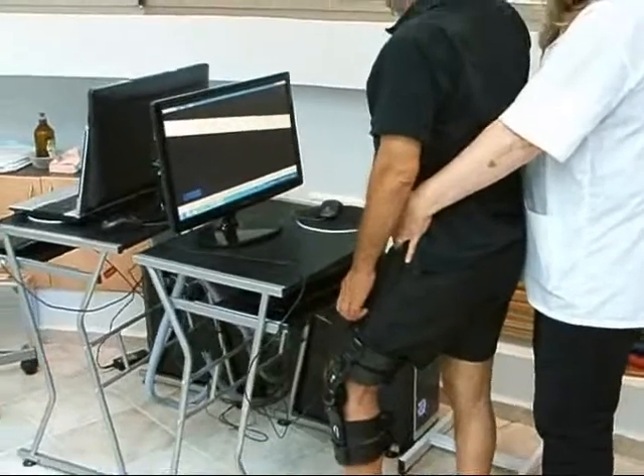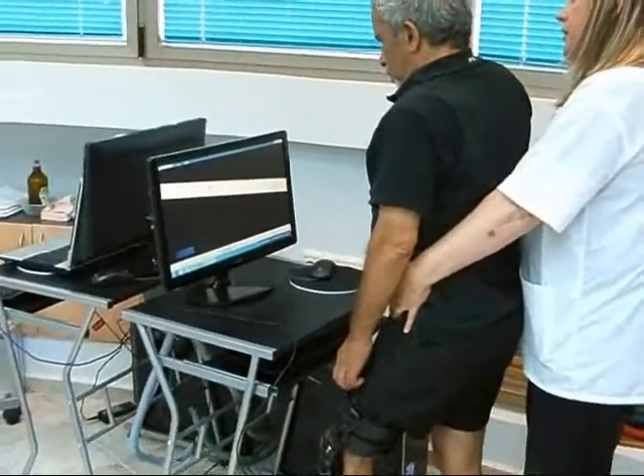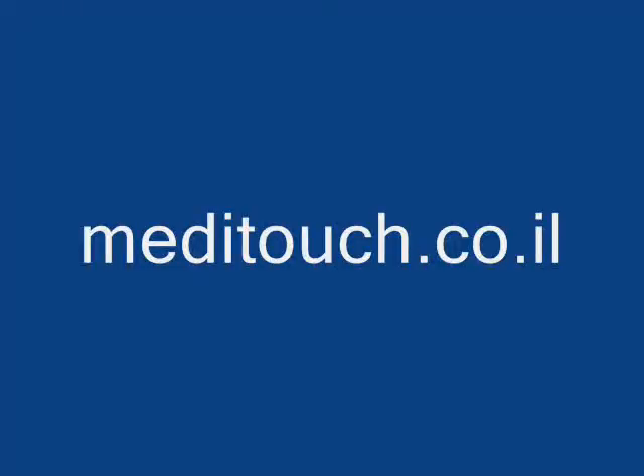The Leg Tutor has full FDA and CE registration and is used in many clinics worldwide. For more information, please visit the MediTouch website.